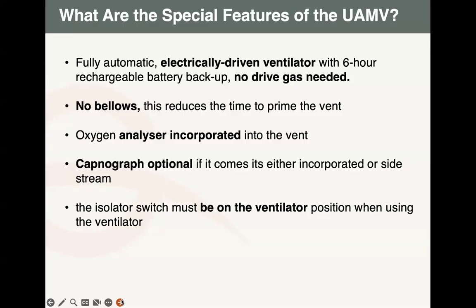Sometimes during anesthesia we can have challenges with power.